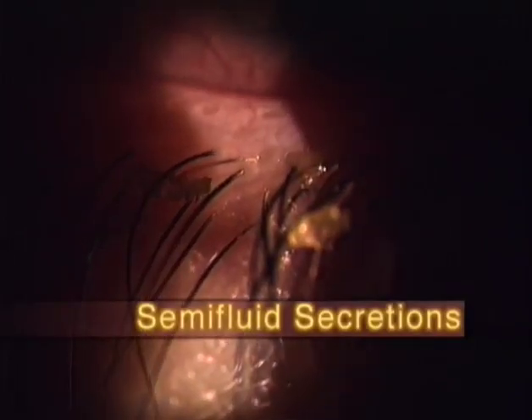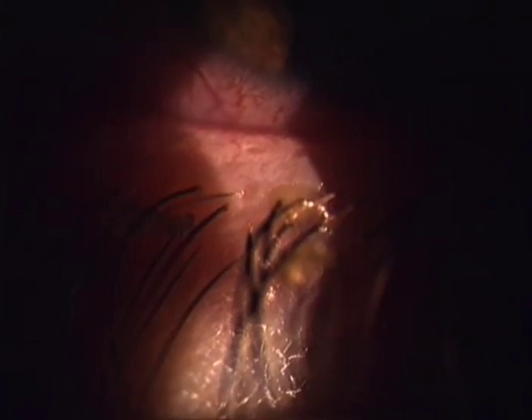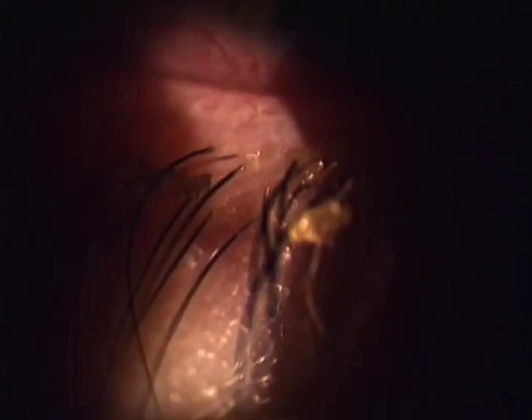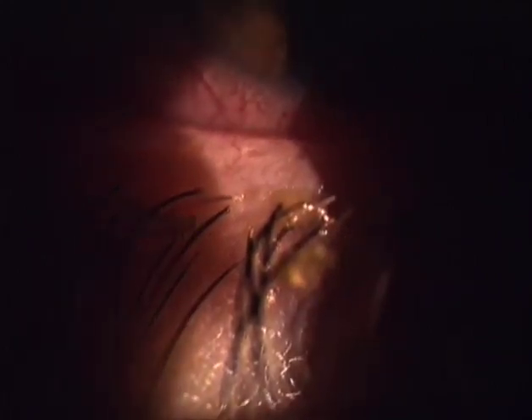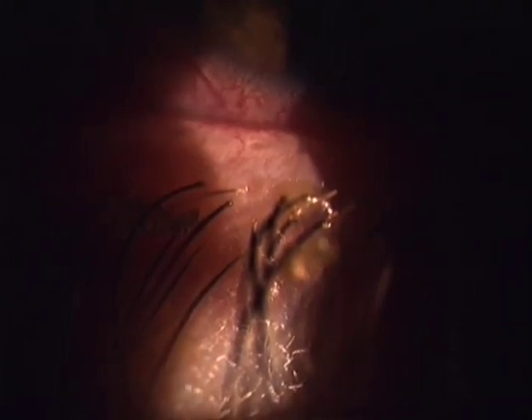Semi-fluid secretions are less transparent, but they are also homogeneous in structure, and thus have an even surface too. Where they cover the skin at the basis of a cilium, they have a regular cyclical or polycyclical boundary. Note the fine strip produced by refraction phenomena in indirect lateral illumination, revealing an otherwise invisible boundary.